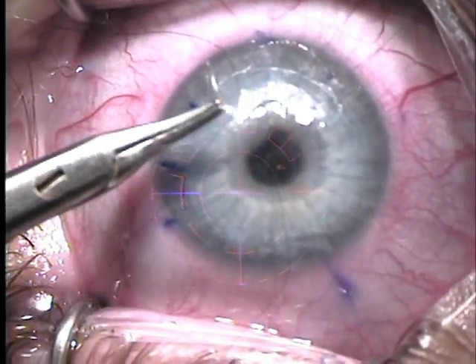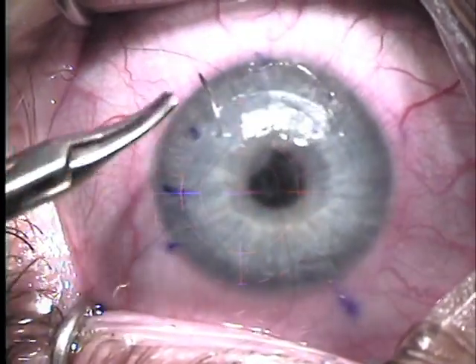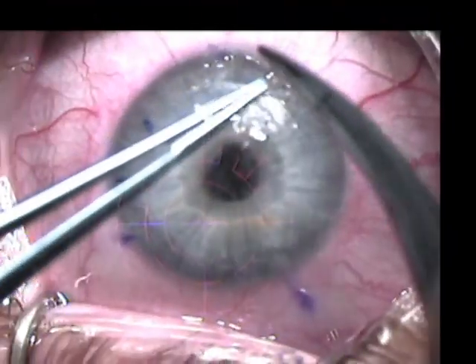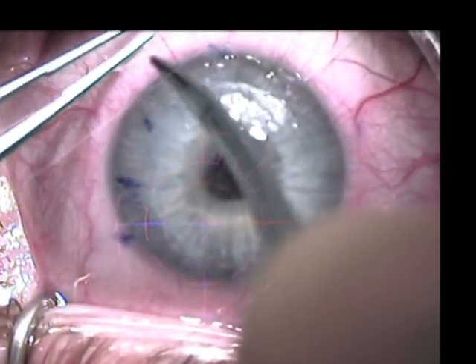This flap had necrosed inferiorly, so a total of eight interrupted 10-O nylon sutures were placed in an attempt to prevent any additional epithelial ingrowth.